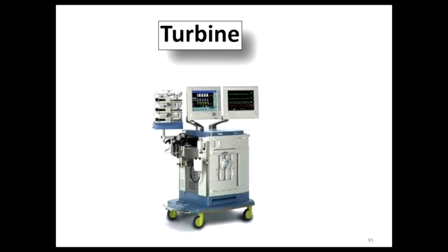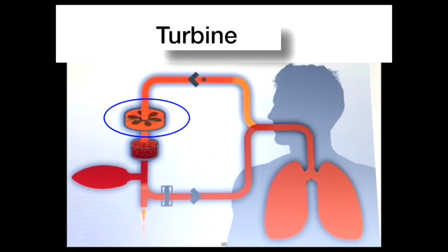Now there is something called a turbine. Turbine is part of the ICU ventilator. On the whole, the majority of ICU ventilators have a turbine. Turbine में क्या होता है?